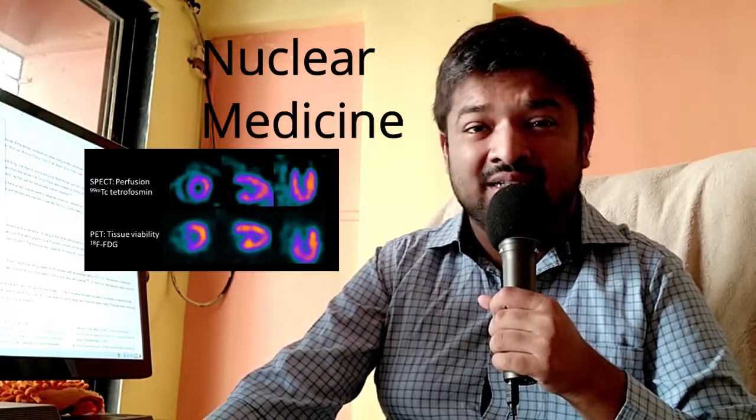Now we come to another modality, which is SPECT and PET. It is nuclear imaging. What we basically have is different radiotracers. They can work in two ways: either a dynamic way, where the tracer goes and works as a perfusion agent, or a static way, where for example only dead myocardium will take up a tracer, or only living myocardium will take up a tracer.